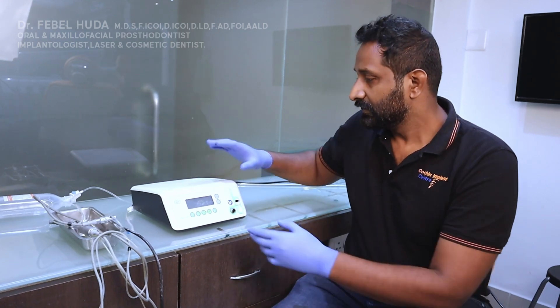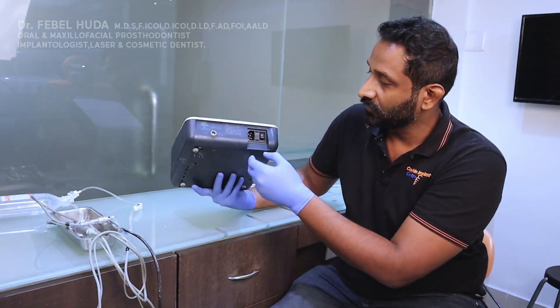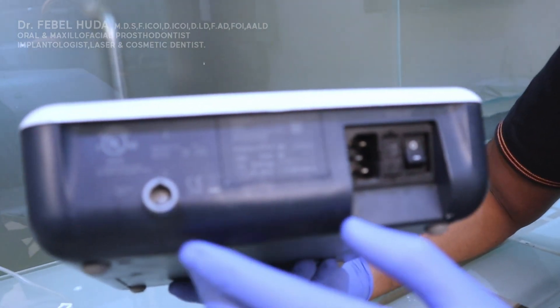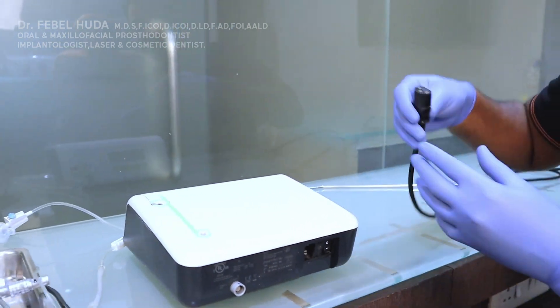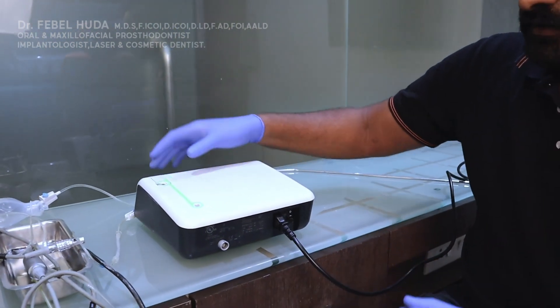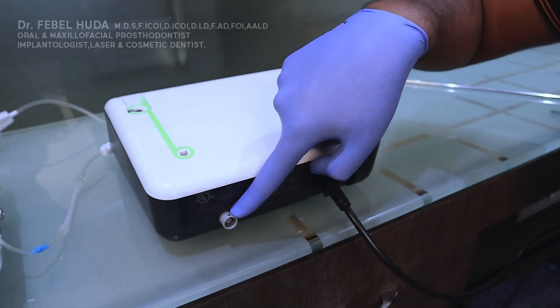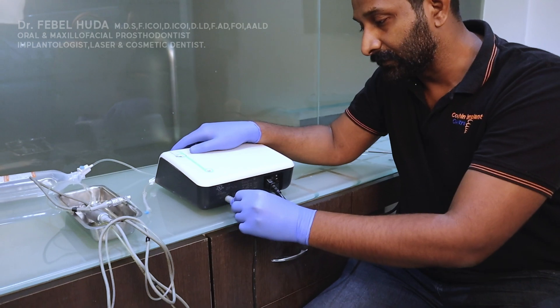First, we'll look at the back of the unit. Over here you have the power cable input and the footrest input. The footrest cable has an arrow marking on it, and there's a corresponding arrow marking on the port — you align these and snap it in.